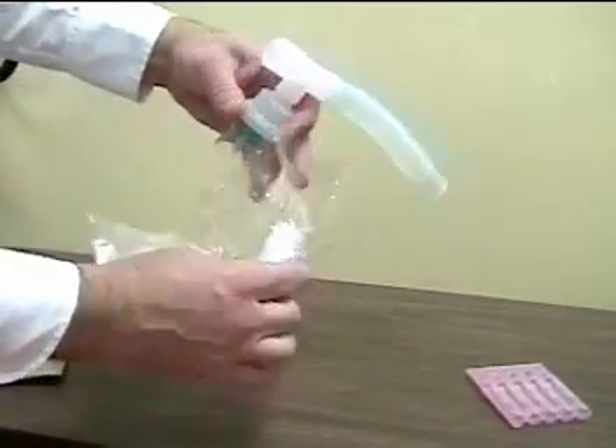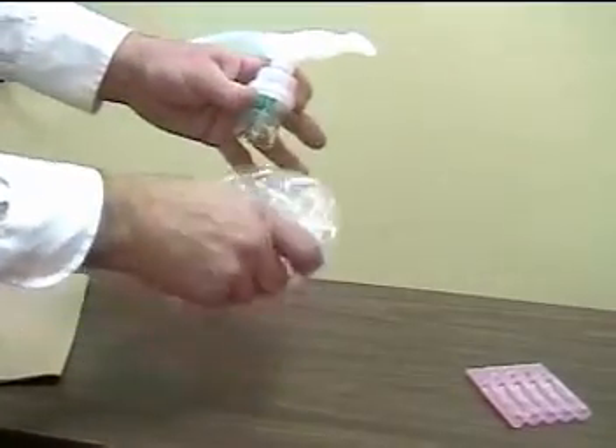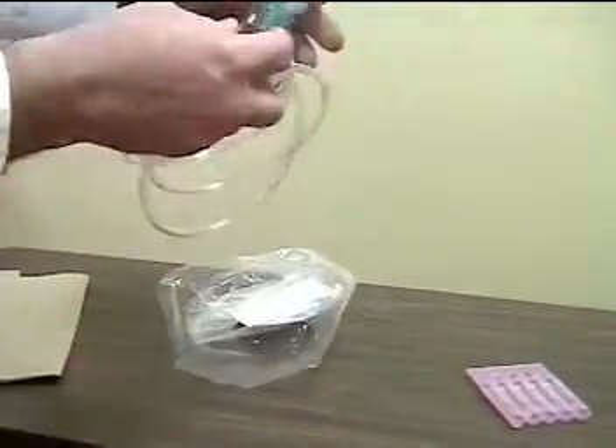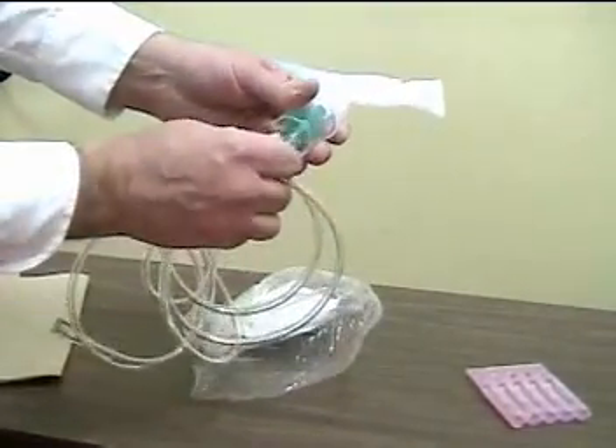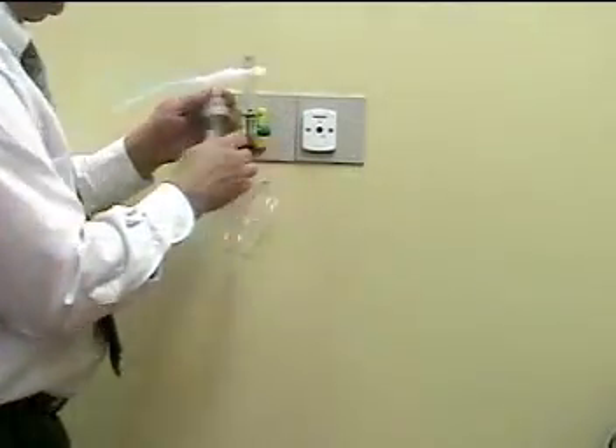The mouthpiece — I typically like to use the bag to hold the mouthpiece so I don't contaminate it. And finally the oxygen tubing, which connects to the underside of the nebulizer. Connect the nebulizer tubing to the flow meter.